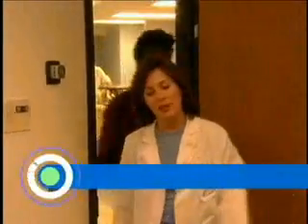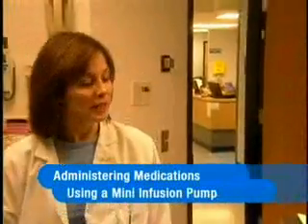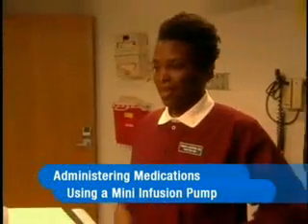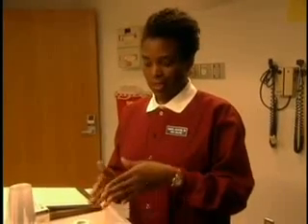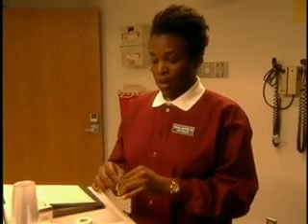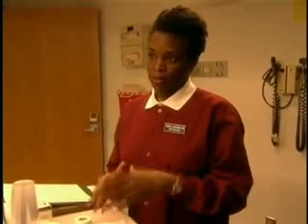Tamika, I'd like to look in on your patient that's receiving intravenous antibiotics. Okay, sure. What will you be doing? I'm going to be administering my patient's antibiotic with a mini infusion pump. That's also known as a syringe pump, right? Right. And what will that entail? That means the pharmacy mixed the medication in a syringe. So I'll be inserting the syringe into the pump, which is connected to the primary infusion tubing. And the pump delivers the medication using a mechanical pressure applied to the syringe plunger.